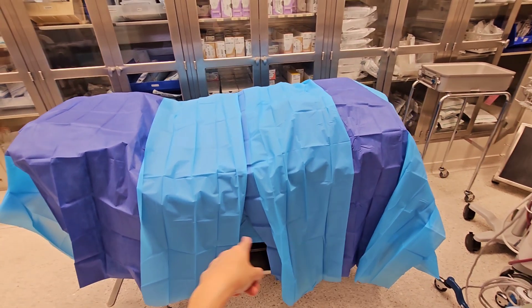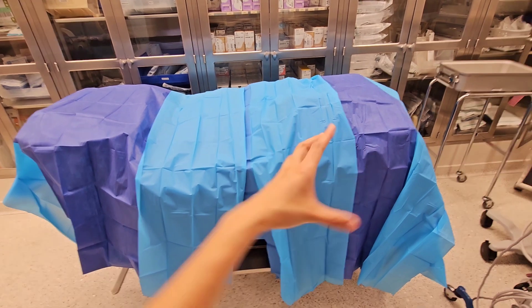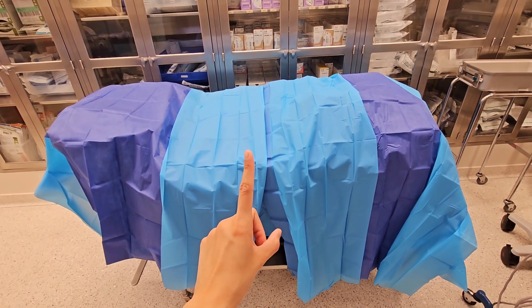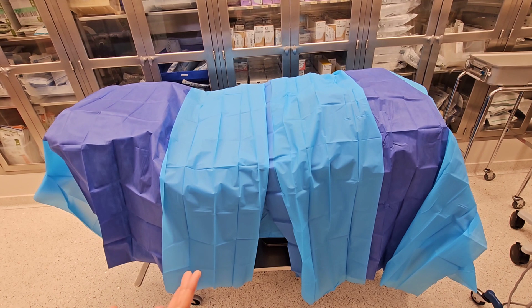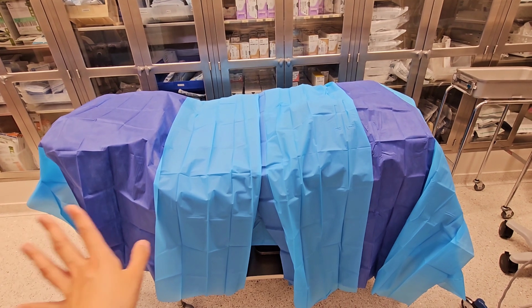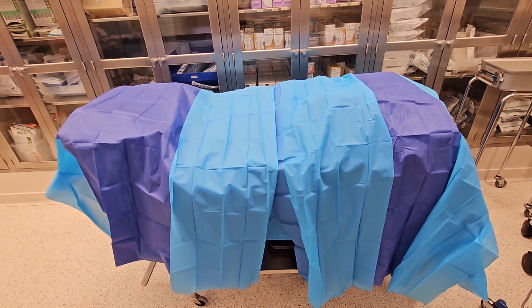Reverting back to my original post — she used just one big table cover and put it this way, so the blue part is facing this way and she only used one. If you really think about it, in order to remove that drape, you have to lift stuff from the bottom up, which is not good because you are taking something from down there to your sterile field, which is no bueno.